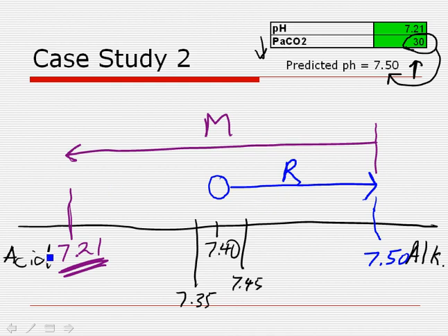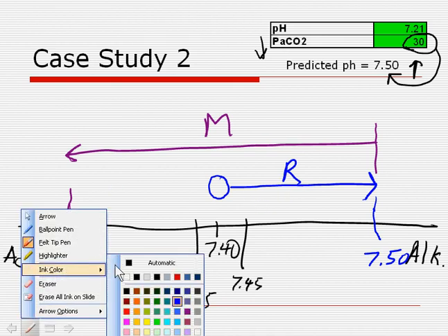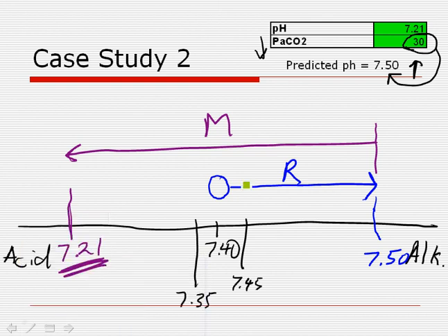So what does this show us now? Wow, that's kind of cool. What I'm seeing is that our ventilatory component is driving us to be alkalotic, but I've got this huge metabolic acidosis that is keeping me on the acidotic side of the equation. So even though I'm compensating with my ventilatory drive, I've increased my minute ventilation, blown off the CO2, reduced the CO2, giving me a higher predicted pH, my overall effect on my patient is that I'm still acidotic.